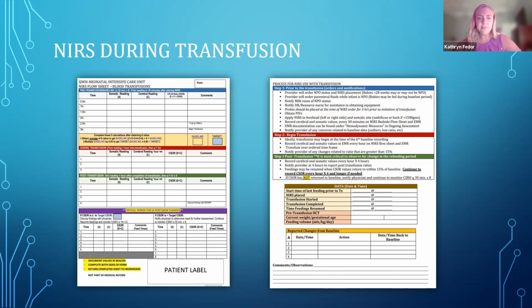So that was our first stage. And that would allow the nurse to begin this 3-hour monitoring period the next morning, as the doctors were coming in for the day. And then they could go ahead and order the blood transfusion and the things that were needed.